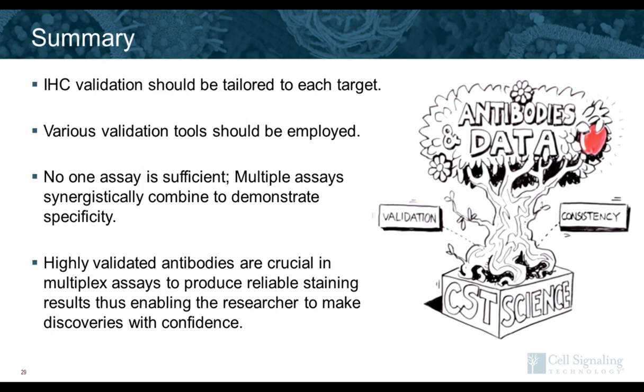I have an antibody that works well in mouse tissue with DAB. Will it work with OPAL? And what adjustments do you recommend? Generally, if you have an antibody that works well in mouse tissue with DAB, then it's most likely going to work well with OPAL. So generally, we recommend trying it with the same conditions that you've been using with DAB. You may find you have to dilute it 2 to 4 times or even higher, though.